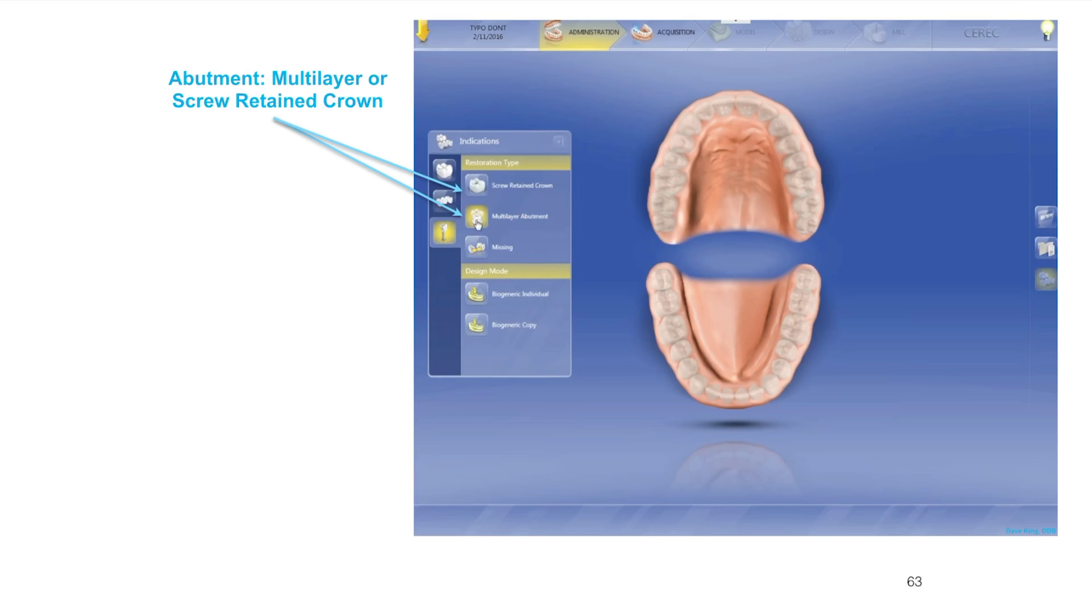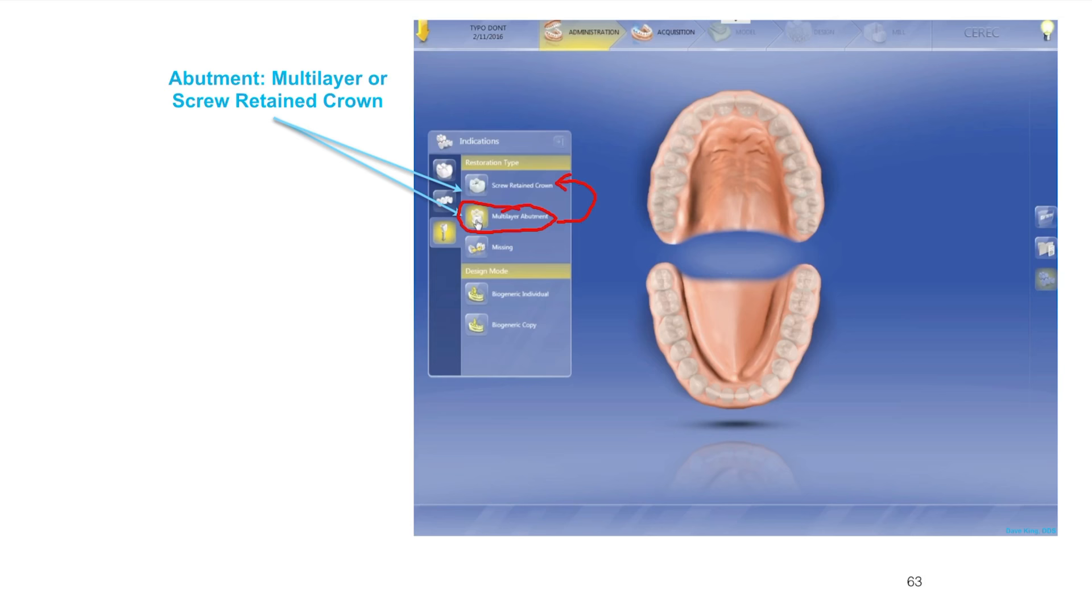I almost always set it up as this multi-layer abutment. The nice thing about it is when I get to the end of the design process, I can opt to either turn it into a screw retained crown, meaning leave it before the split, or you can go ahead and split it.